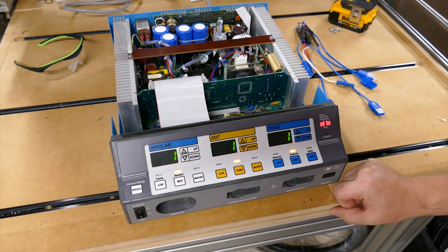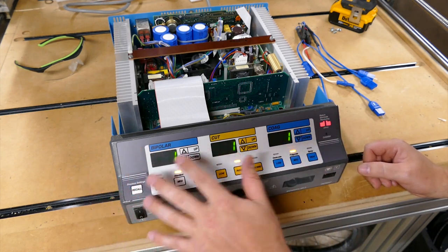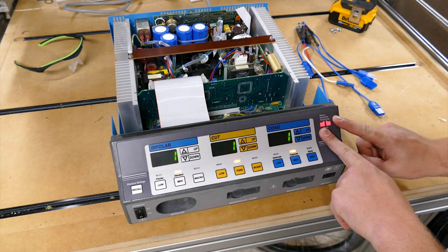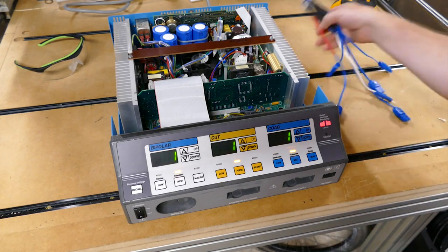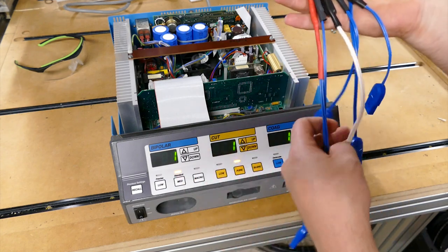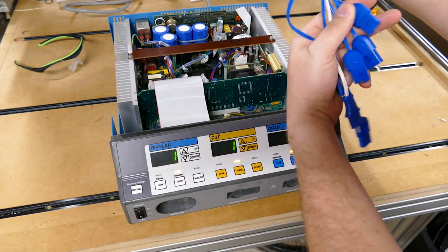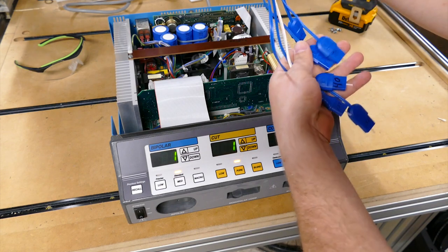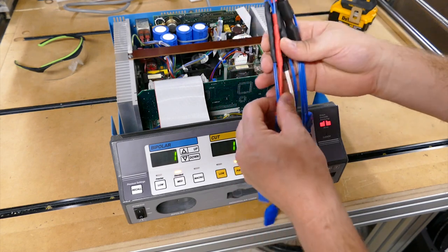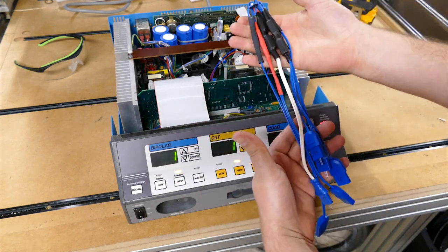So what is going on with this beautiful piece of history? Well, this guy right here. All the rest of this will probably be just fine, never give you problems, almost never need calibrating, but your return electrode monitoring can give you issues. If you look here, I've got a set of calibration keys that we made here in the shop. Some of them are verification keys. You can see I have 140 ohms, 135, I've got 130, 70, 10. But anyway, we'll get into that later. These are keys that I made myself, and we put resistors in line, curved the cable back over, which makes a neat little loop so we can bind them all together.